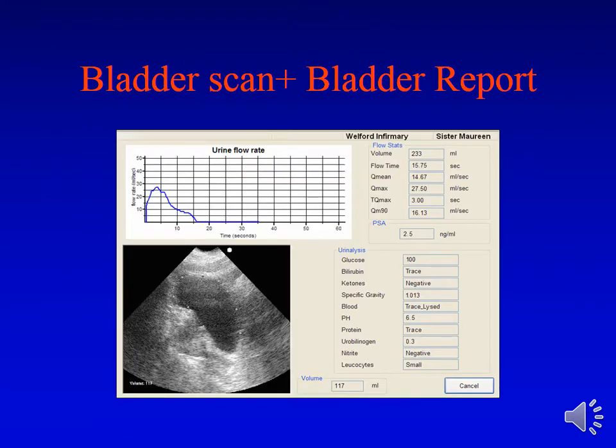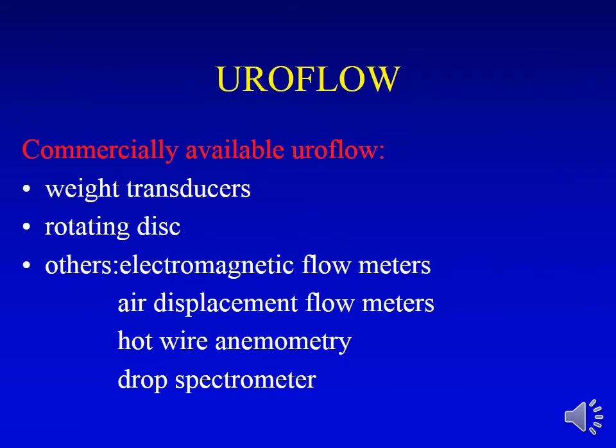This is a bladder scan and bladder report. This is actually a post-void scan. I usually do pre and post-void. By looking at the bladder scan, we can know the post-void residual and determine the bladder voiding efficiency itself.